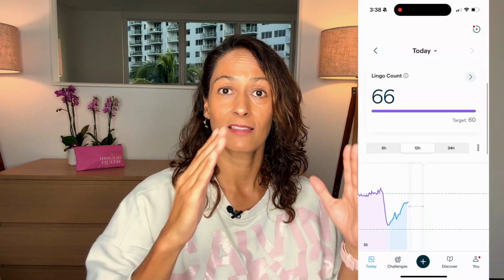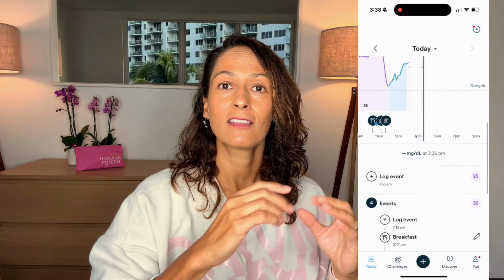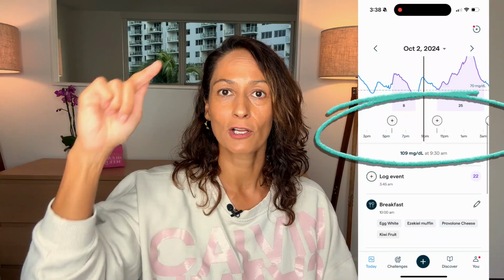Just like with Dexcom Stelo, you can log your activity and your food directly in the Lingo app. And what I really liked is that that activity and that food then showed up directly on the blood sugar graph in the app. It made it really easy to quickly see the correlation between what you're doing, what you're eating, and your blood sugars. This is a very high level of what Lingo can do.